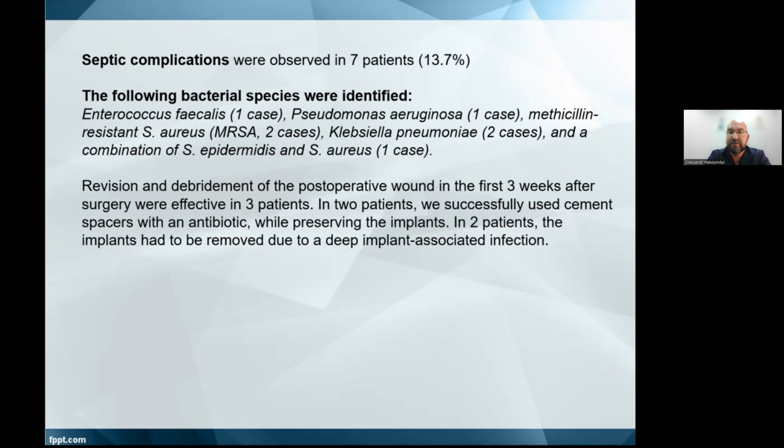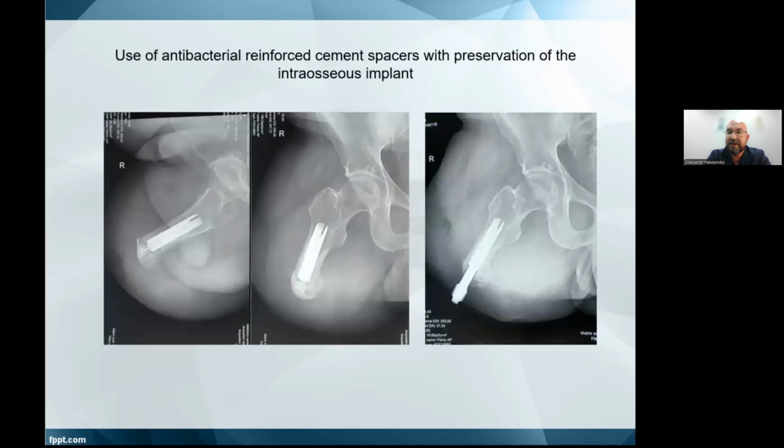It is very important not to be afraid to do a revision of the postoperative wound with debridement in time. This was effective in 3 cases out of 7. In 2 cases, we had to do a second revision. We took away the plug elements and temporarily replaced them with a reinforced cement spacer with an antibiotic. And we are pleased with the result. On the slide, you can see X-rays before and after treatment.